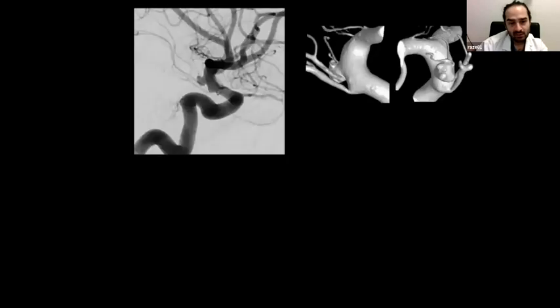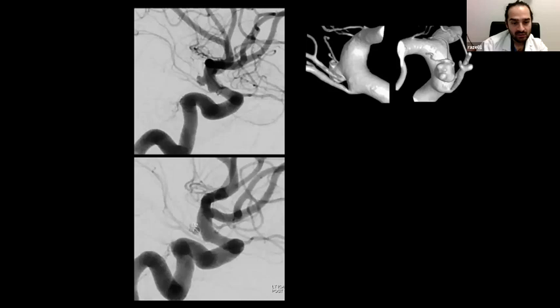And I saw this image, and I coiled the aneurysm without being too aggressive, meaning that there was a second stage plan with a flow diverter here, but I put enough coil to secure the aneurysm. And what I didn't notice immediately is that, just by putting the coil, okay, the choroidal artery, I kept it open, and that was very important. That was the thing that I was really careful about.